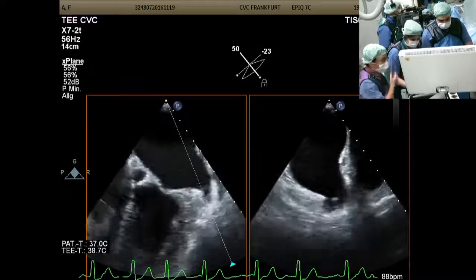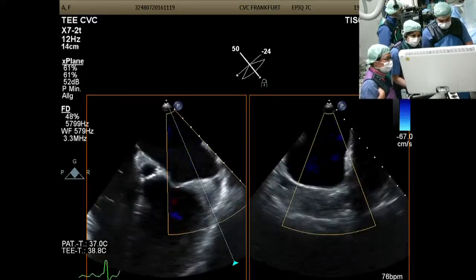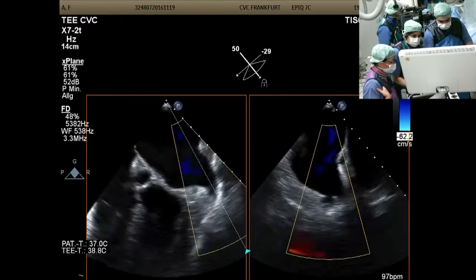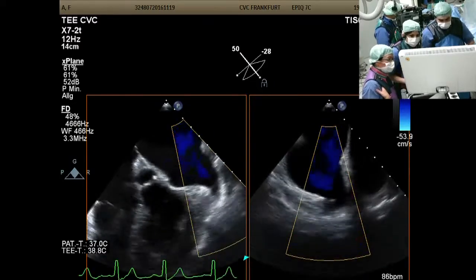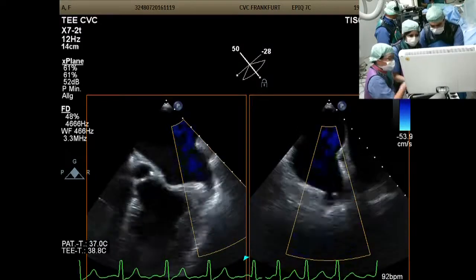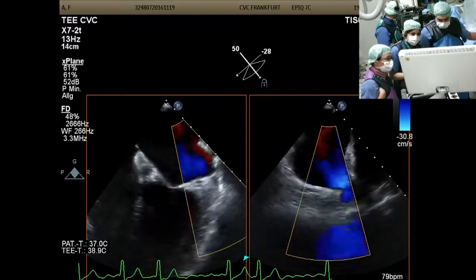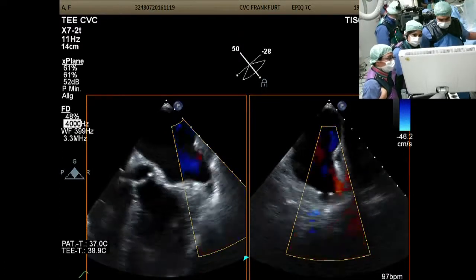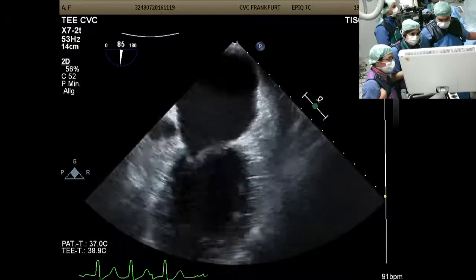Could you put some colour on, please? Yep. Oh, sure, thanks. So, colour, wrong button. So we can't see much in the way of colour. We can bring the scale down as well. Oh, good, you've done that. So we've taken the scale right down to around 30. So again, we're seeing nothing. And we'll just go back up. Lovely, which you did. And we're just going to keep going round now, if that's all right. We've done 0, 50, now we're doing 90.